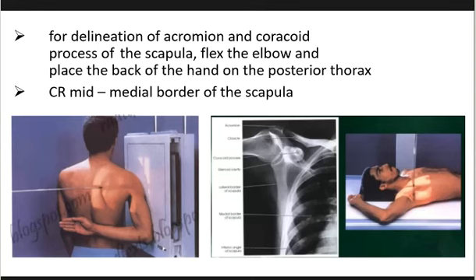Breathing technique, in other words, slow breathing or quiet breathing. So dalawa na ang ginamitan natin ng breathing technique. Ano yung isa kanina? Lateral projection of the thoracic vertebrae. At ano yung isa ngayon? We have the AP projection of the scapula. Yan ang mga ginamitan natin. Meron pa tayong madadaanan mamaya na mga ginagamitan natin ng breathing technique.